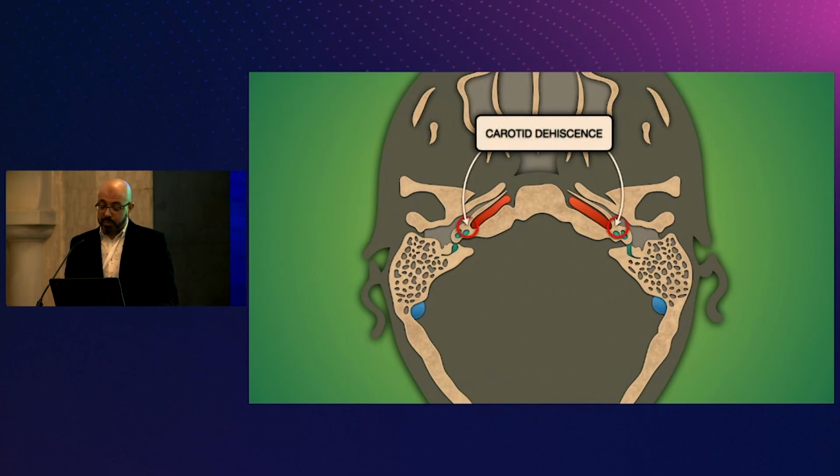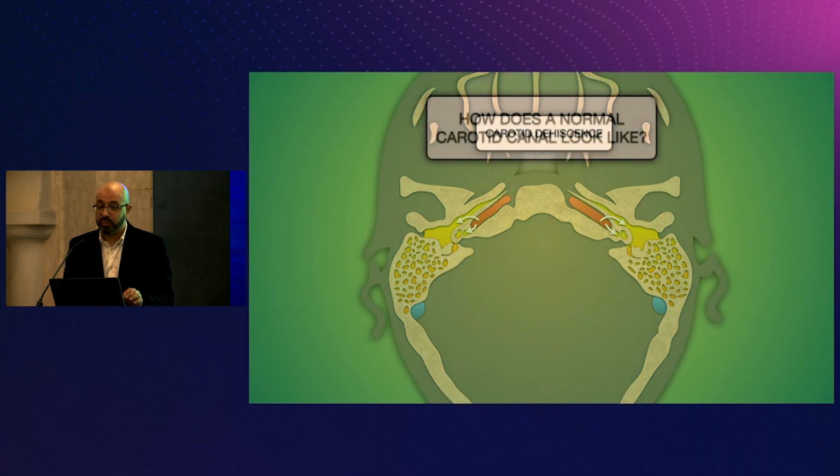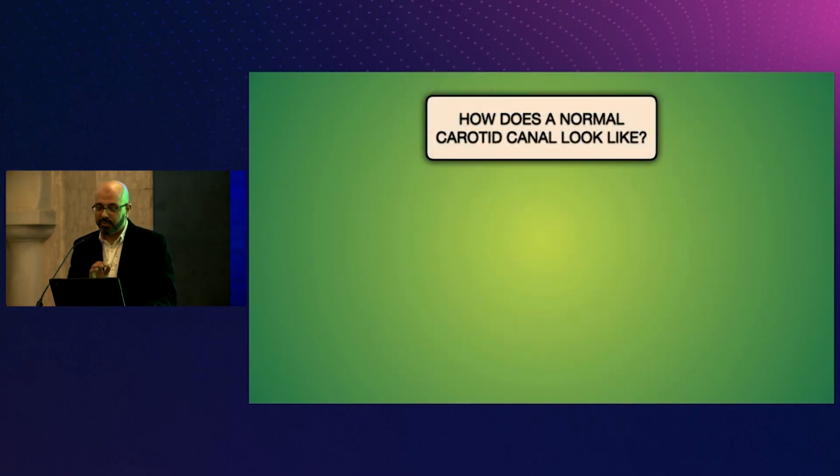The next vulnerable spot is carotid dehiscence. So carotids can be dehiscent in 2 different areas, either directly with the middle ear cavity or the petrous apex, and the second site is between the carotid and the cochlea itself, which we call carotid cochlear dehiscence. And this actually can happen with either the apical turn or the basal turn of the cochlea. It's a very tricky diagnosis to make, so you need to be very, I would say, paranoid to spot it. That's why you need to prepare a checklist of all of these dehiscences.